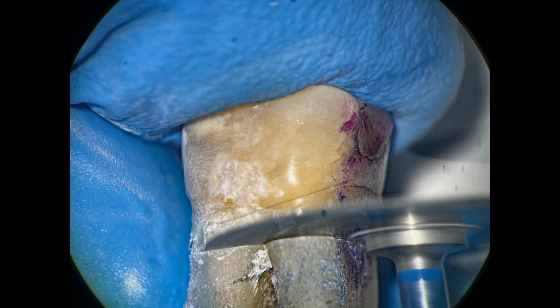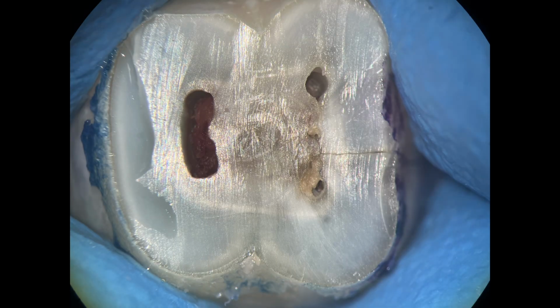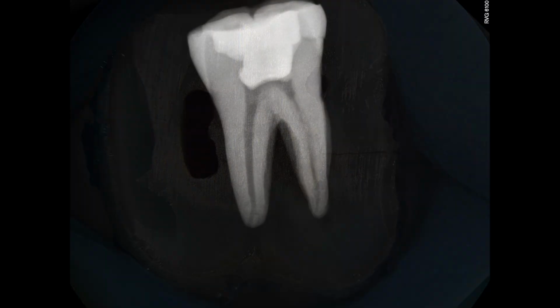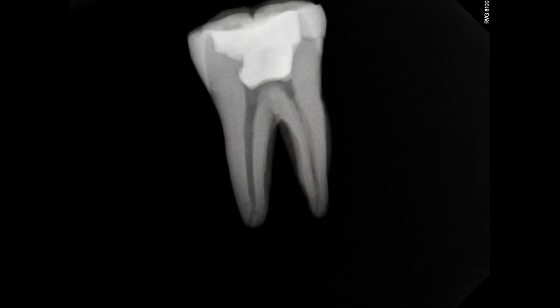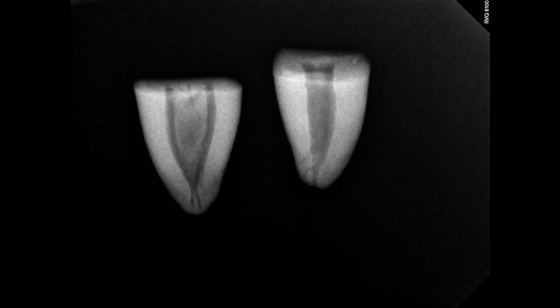I sectioned the tooth axially right below the bifurcation of the root, and then we split the root into a mesial part and a distal part, and then imaged those radiographically separately from the mesial direction.